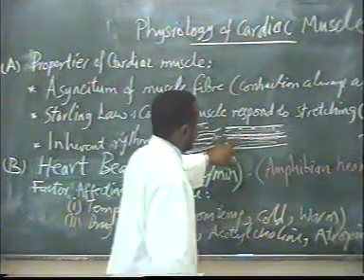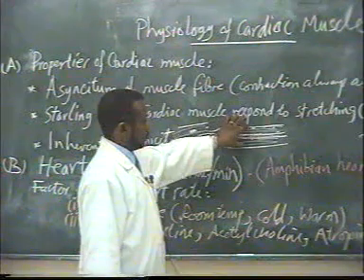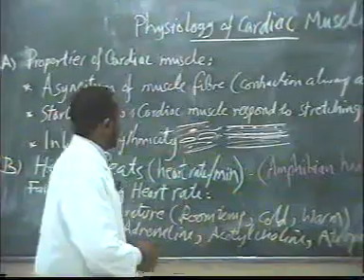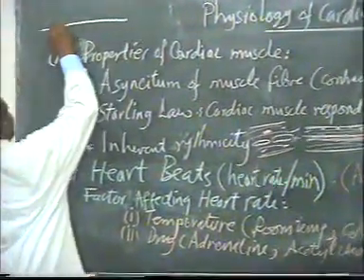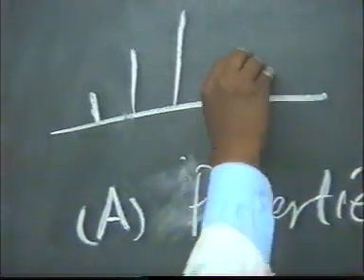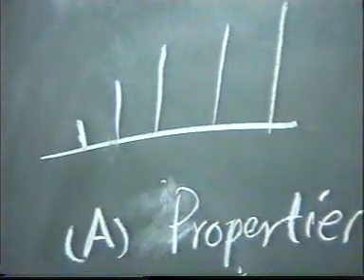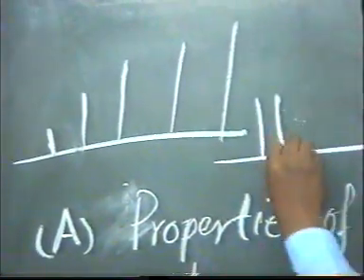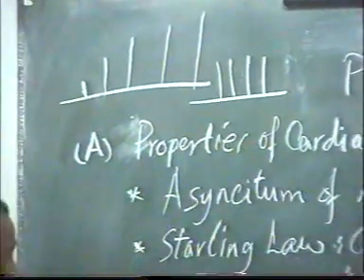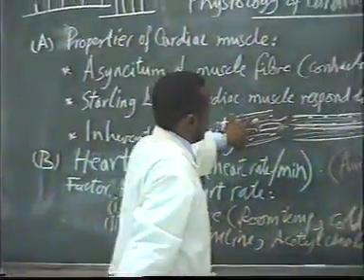But in case of the skeletal muscle, there is a variation in the sensitivity of the motor units, so they can respond to different levels of stimulus. This is why, if you increase the stimulation, you get better and better responses until you reach the maximum. But in case of the cardiac muscle, the response is always the same, because the whole musculature contracts only for the maximal stimulus, which is enough to stimulate the whole musculature.